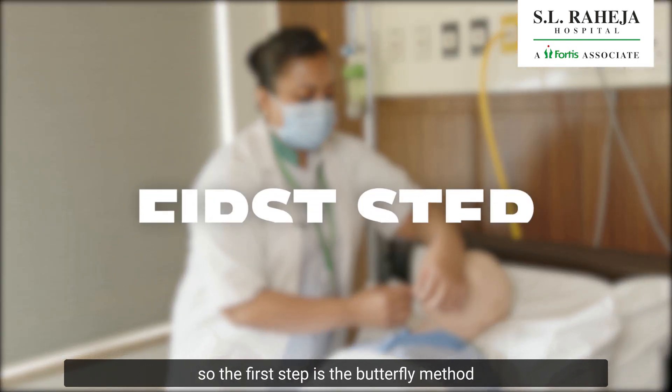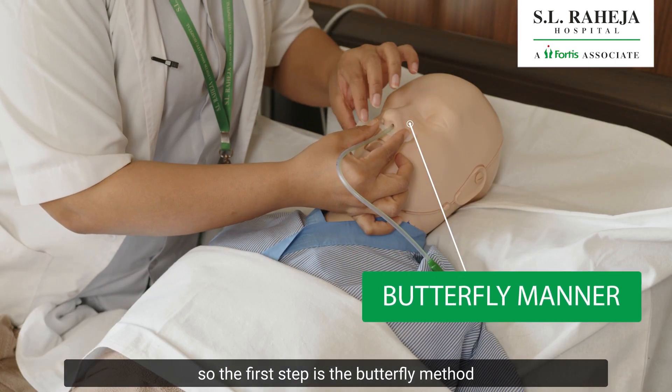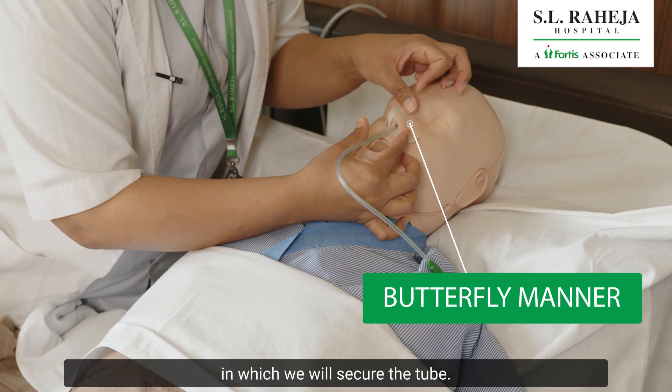So the first step is the butterfly method, in which we will secure the tube.